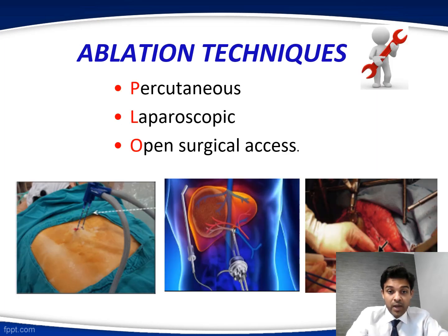Now, the various approaches to various ablation techniques. So the main three approaches: percutaneous, laparoscopic, and open surgical access. Percutaneous means through the skin. Laparoscopic is a fine incision, a small incision. And as it suggests, open surgical is a larger incision and by opening.